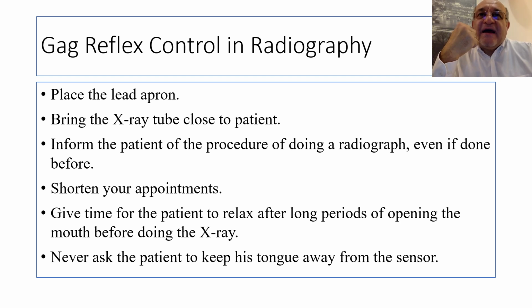I don't mention the gagging. Tell him that this procedure might cause some discomfort. The idea is that the patient is going to be relaxed by the patient behavior from your side.